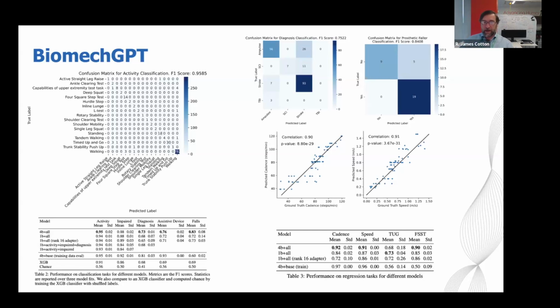And there's the opportunity to take that biomech agent that can write code to actually create additional feedback to BiomechGPT. So there's a whole field of reinforcement learning from verifiable feedback that's been exploding in recent years, and that's definitely on our roadmap.